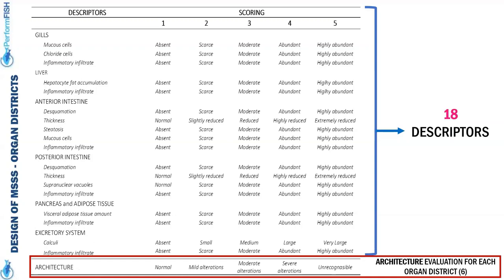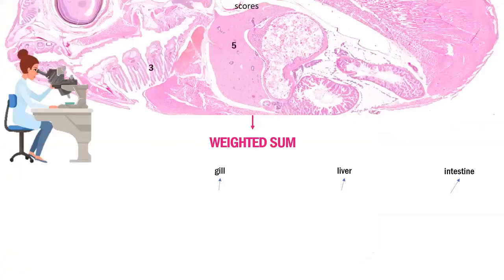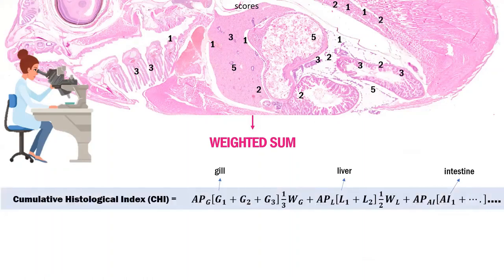So that is a huge quantity of data, especially considering that 20 fish per age, per batch, were evaluated. And so the scoring system of the descriptors was defined and put to the test. Our main goal was to provide results that would be transferable and immediate, even for non-experts.